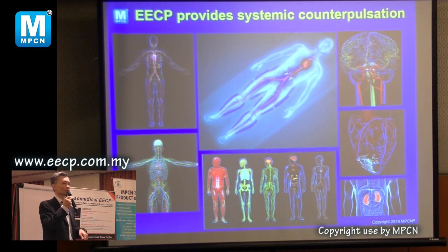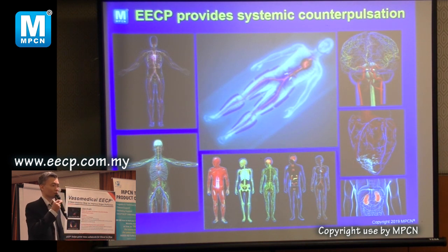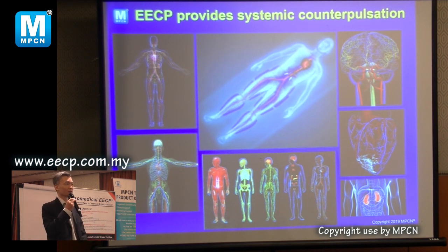If it shows bleeding, you cannot do it, because if you force so strongly, it can cause another stroke. But if it's an ischemic stroke, not because of bleeding, this machine may help. Some small studies show that it improves their recovery from the stroke. If it's bleeding, cannot.